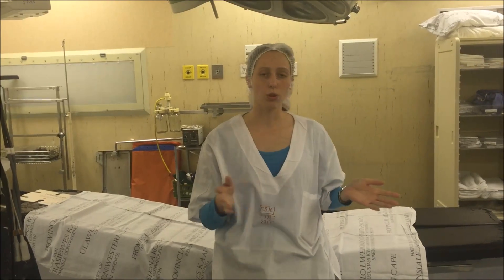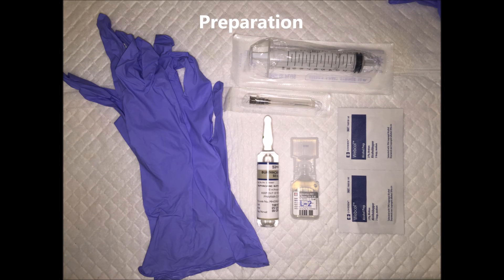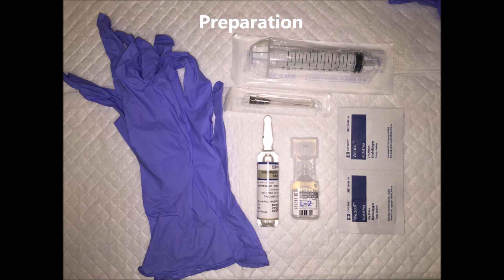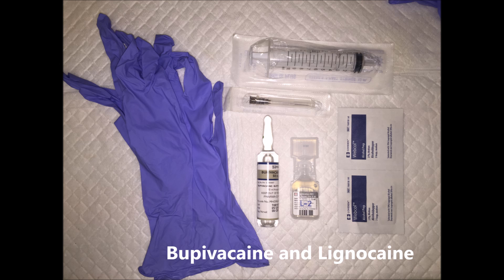You will want to organize all your equipment and prepare the patient. This will involve getting consent from the patient — they will need to know what you will be doing and why you will be doing it. For this procedure, we will be using a combination of 0.5% bupivacaine and 2% lignocaine.